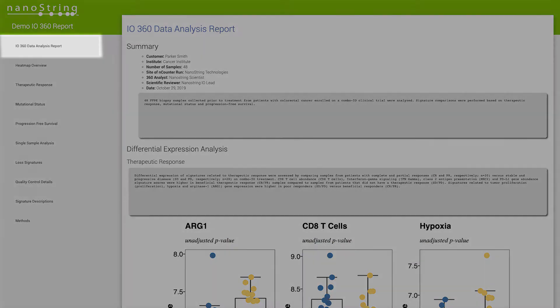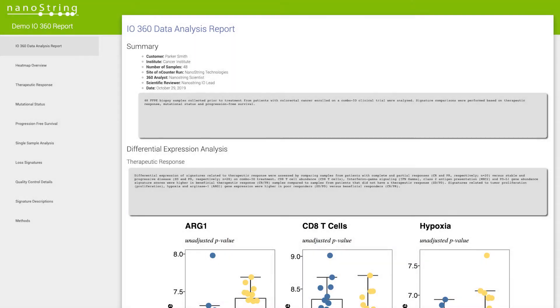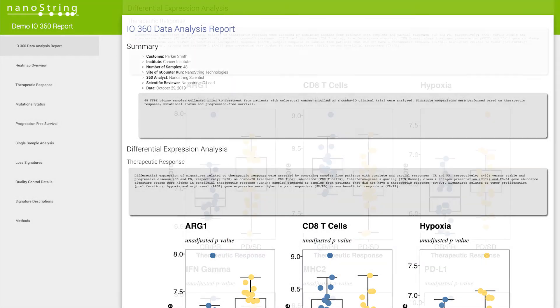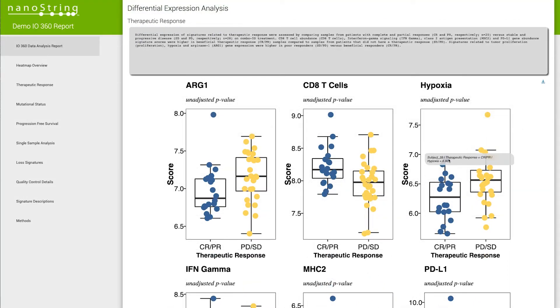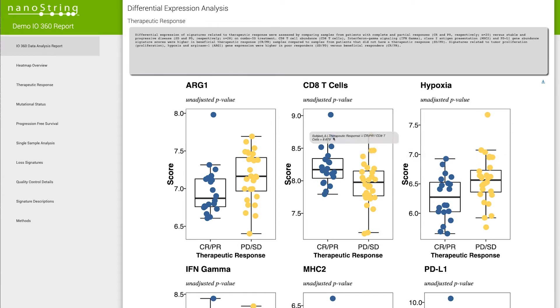The summary section includes content written by the scientific lead of the project, as well as box plots of significant findings. Hovering over a single point in the plot displays more detailed information, a feature that is available throughout the report.